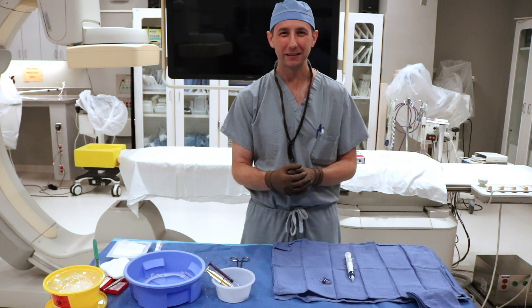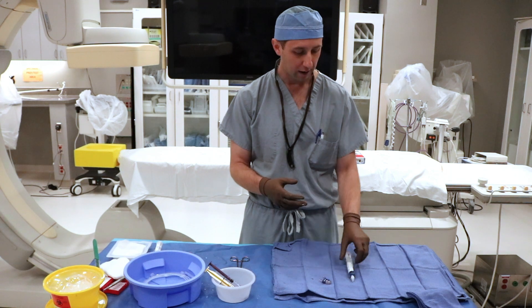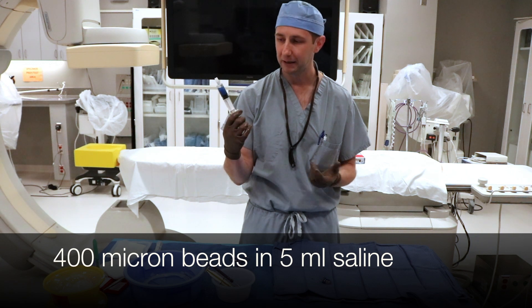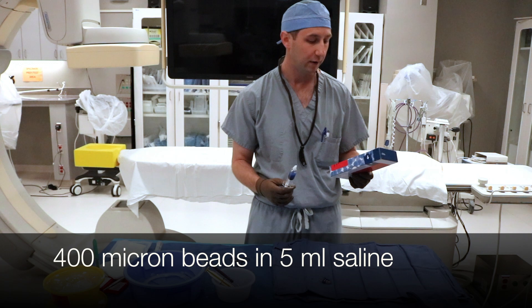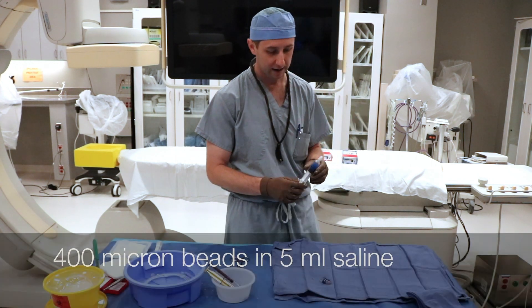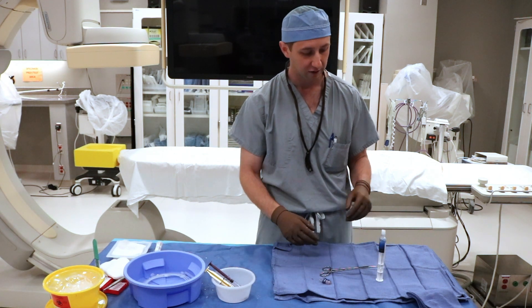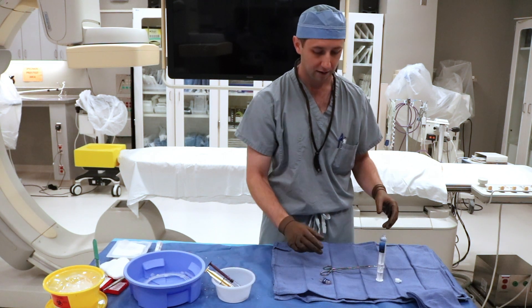All right guys, this is Chris back with the back table team. I'm going to show you how to mix up some embozine. We have some 400 micron beads from Boston Scientific — as you can see the beads are color-coded. These are 400 micron, so it's 2 ml of beads and 5 ml of saline. If you have your beads out, you can go ahead, make a little kickstand, and get the beads to settle to the bottom.